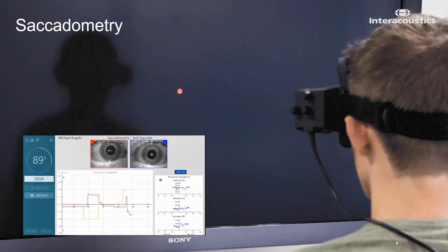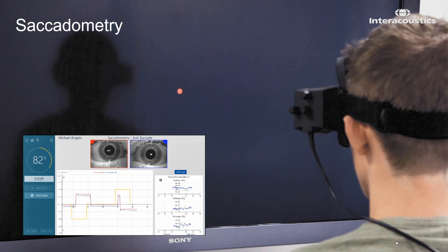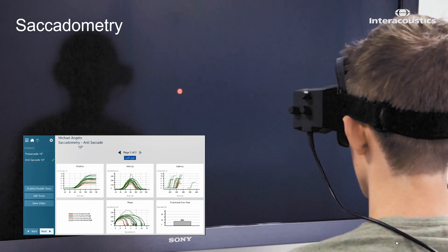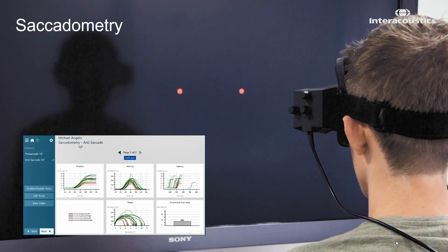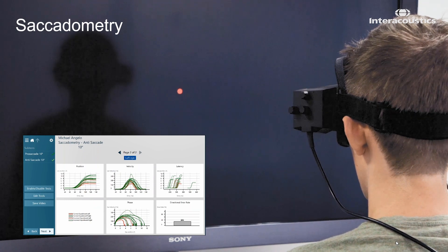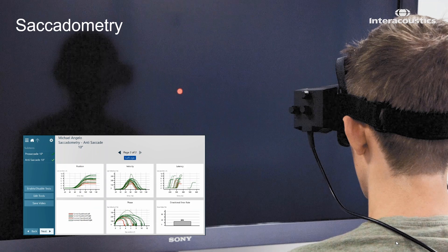What do we need to do in VNG to examine things in more detail, if we're already looking at oculomotor tests in traditional VNG — random saccades, smooth pursuit and gaze holding? This moves us towards an advanced oculomotor assessment using both pro- and anti-saccade assessments to quantify eye movement behaviour over different ranges of time, duration and velocity. This gives us greater sensitivity in detecting neurological changes such as central disorders, neurodegenerative diseases, movement disorders, traumatic brain injury, and other neurologically focused pathologies.